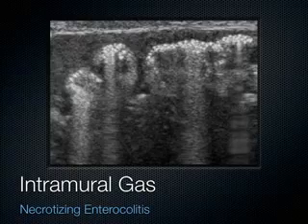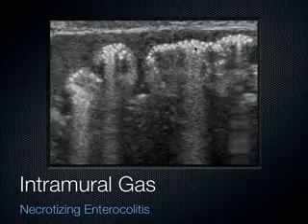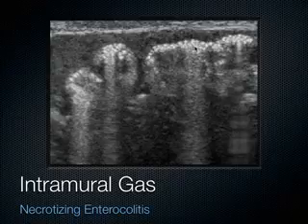And just another example of a patient who had necrotizing enterocolitis. We can see all these punctate lesions here, with some shadows. Now, people always ask me, does air cause dark shadows or bright shadows? It causes both. Sometimes it causes dark shadows, sometimes it causes bright shadows.